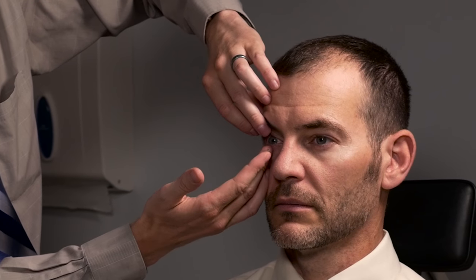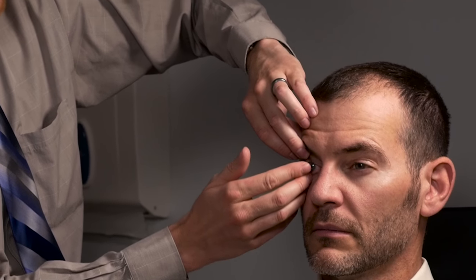After cleaning the contact lens, I'm going to have the patient keep his head level and look straight ahead. I'm going to pull down on his lower eyelid and pull up on his upper eyelid and set it directly on the front surface of his cornea, just like that. Have him blink normally and let it settle down a little bit. It's very common to have some tearing, especially with a GP lens when you first place it on the cornea. In some cases I will first put one drop of proparacaine on the eye before doing so — it helps reduce tearing and helps the patient adapt to the contact lens at least a little bit easier.